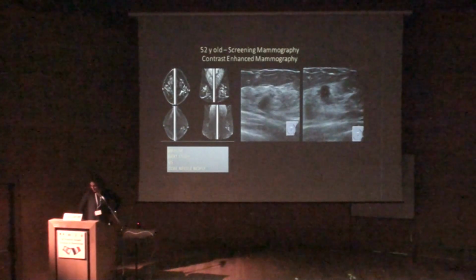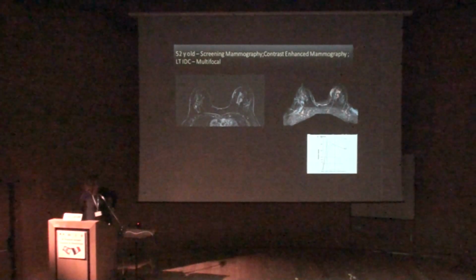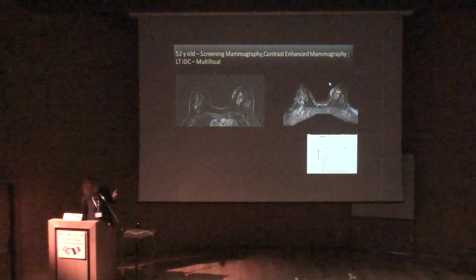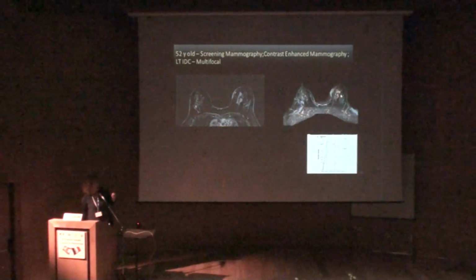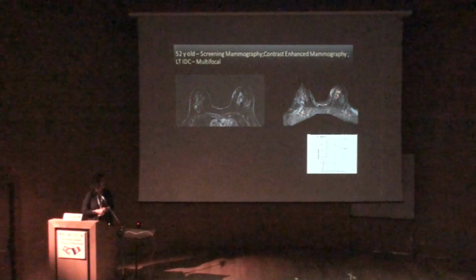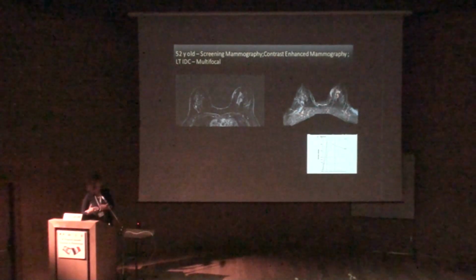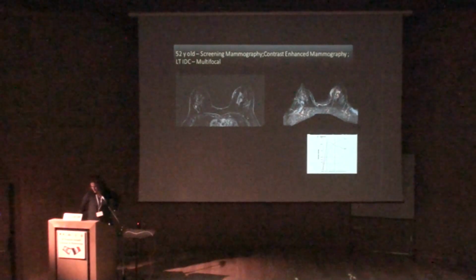Okay, but before, although we had the contrast mammo, we still did an MRI, and on MRI, we saw, again, the same 3 lesions, okay? And here we can see also the time enhancement curves, but also again, look, the lesions are very typical for carcinoma. There is more red than blue. However, the enhancement or the color inside the lesions is heterogeneous. And we know today that there is a heterogeneity in breast cancer, in the lesions. And the meaning is the more heterogeneous the tumor, the more violent it is. So today we have more and more literature about the significance or the importance of the heterogeneity in breast cancer. I think in every cancer, but I'm speaking about breast cancer.